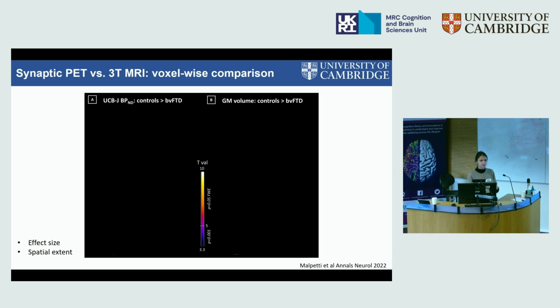In particular for synaptic PET, we wanted to be sure that we were not just picking up atrophy, and not picking up something that you can easily measure with just structural MRI. So we compared the two techniques. We took different approaches to compare them and be sure that what we were looking at was something else.